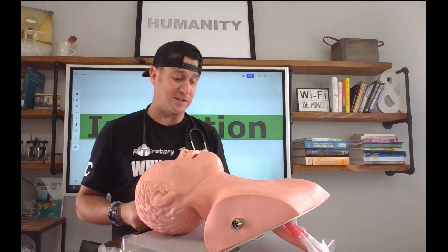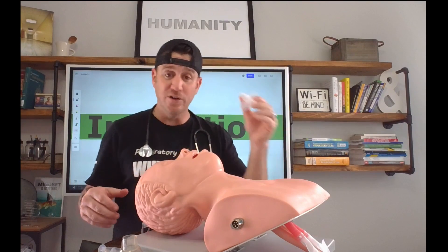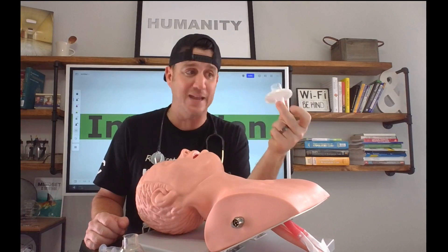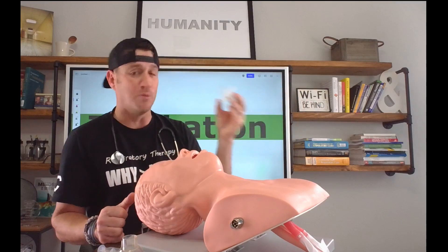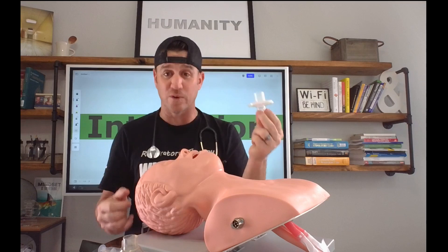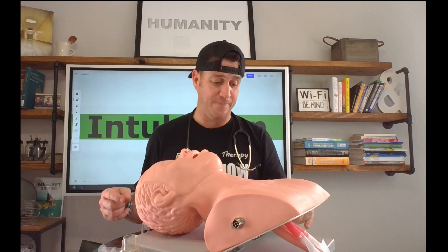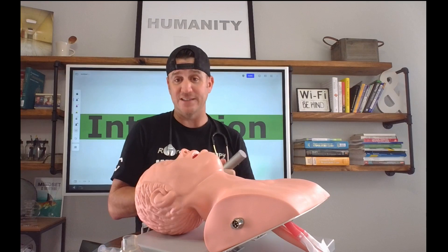Now I have everything I need to intubate this patient, including my end-tidal CO2 detector. Now we all know this is a bacteria filter, but we're just playing the game today because I actually don't own one of these. So we're going to utilize this — just for today, pretend that this is your colorimetry device that is going to change colors in the presence of detected CO2. We'll be utilizing this here shortly. Now we've bagged our patient and we are ready to begin the process of intubation.